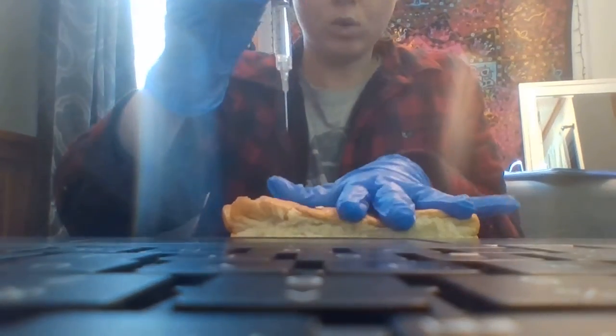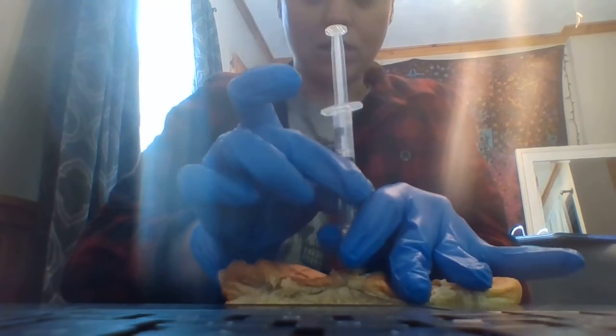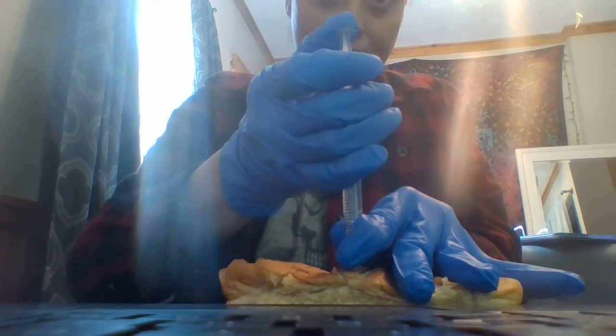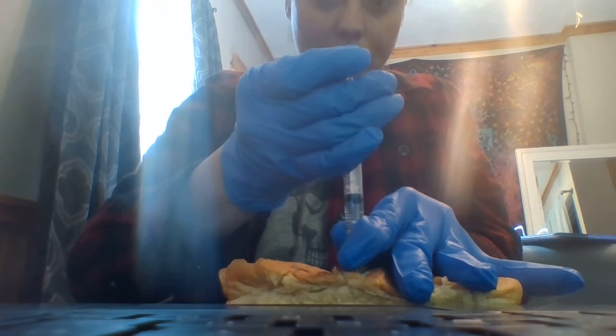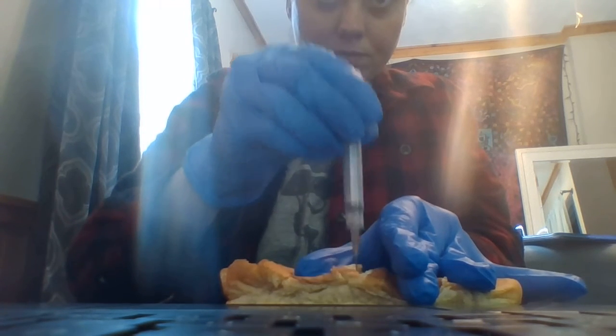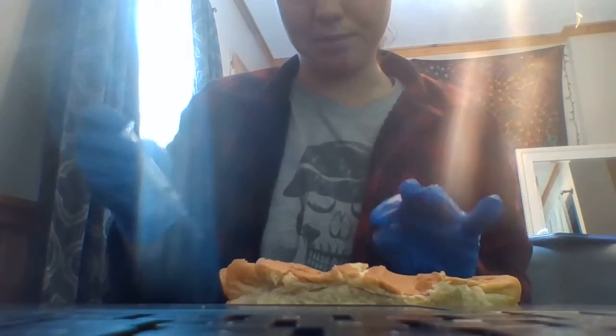Okay. I'm holding the skin. I want you to be able to see. Sorry. I'm injecting it 90 degrees. I'm going to hold that and then I'm going to press down, injecting it in. Remove it, and then I will take my hand off the skin.